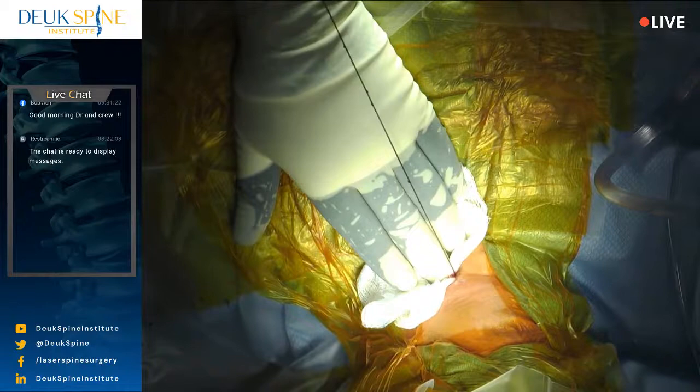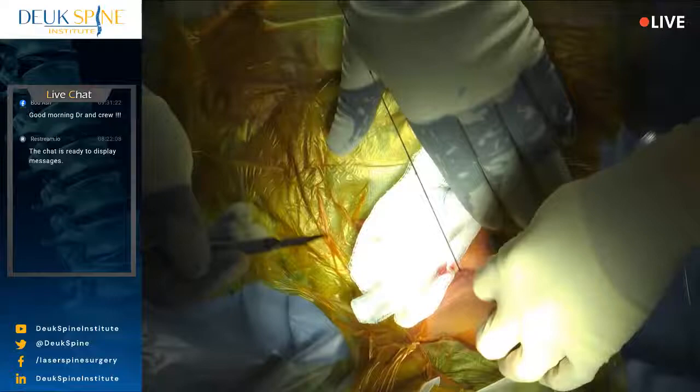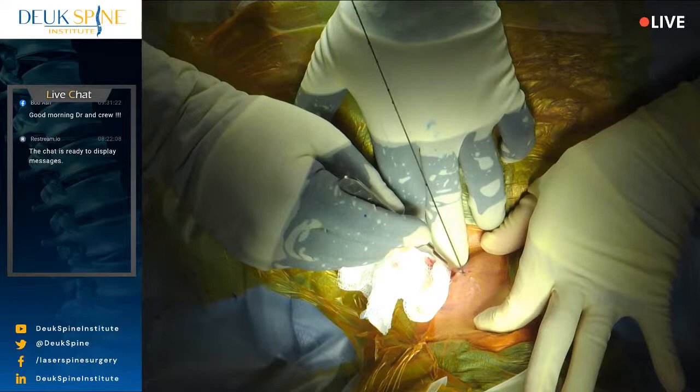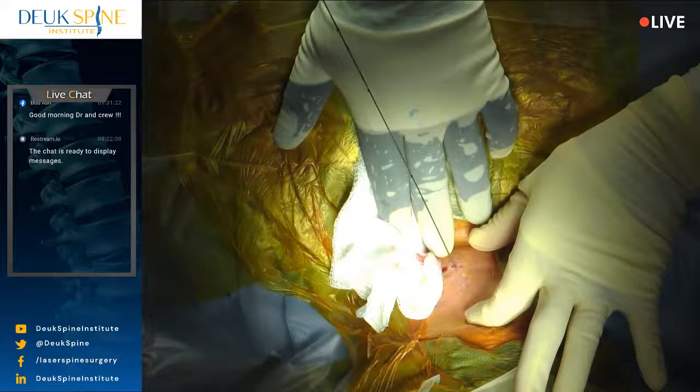And to place the guide wire properly, you have to have reliable information, reliable landmarks. Every guide uses landmarks and knowledge and experience. And this is no different in spine surgery when you're doing minimally invasive endoscopic surgery. We need landmarks. And the landmarks I use during the fluoro are the spinal anatomy, the vertebrae, the discs on AP view and lateral view.